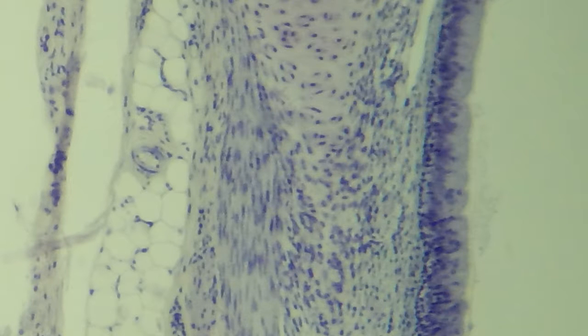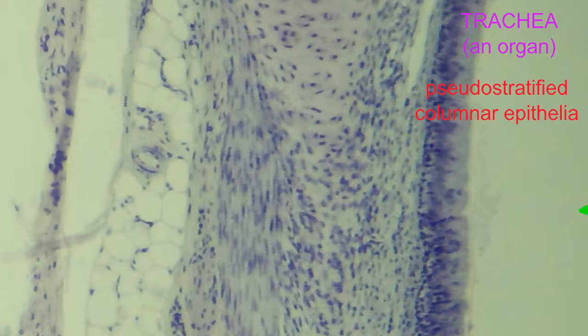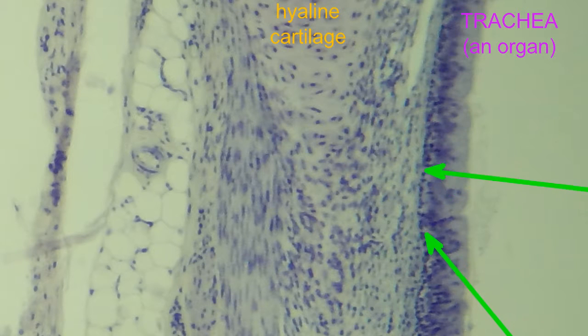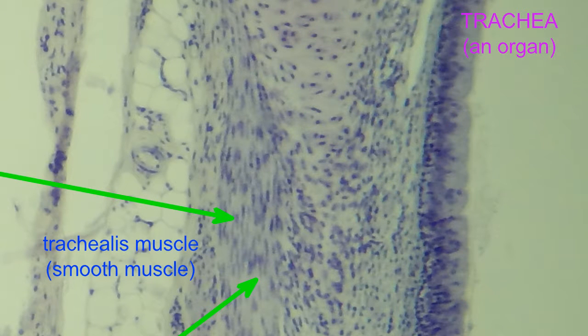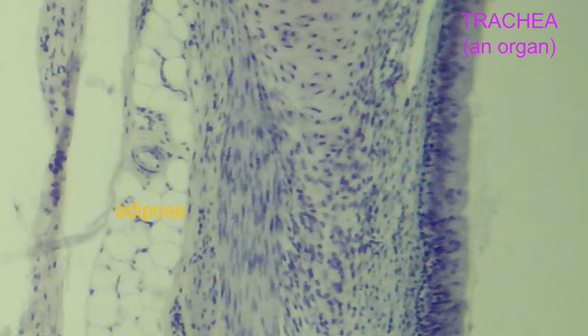So, for example, in this slide of the trachea and the esophagus, the trachea is composed of multiple tissue types since it is an organ. It is lined by pseudostratified columnar epithelia. It possesses C-shaped rings of hyaline cartilage, which is a connective tissue. In the posterior of the trachea, a smooth muscle band known as the trachealis controls the diameter of the trachea. And then there is also areolar connective tissue and adipose in the vicinity as well.